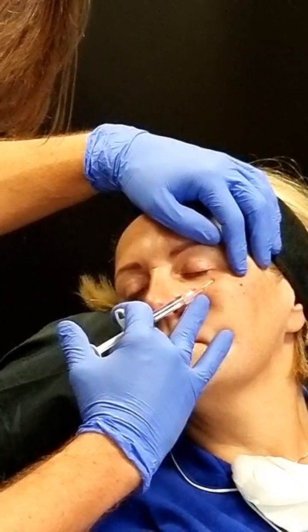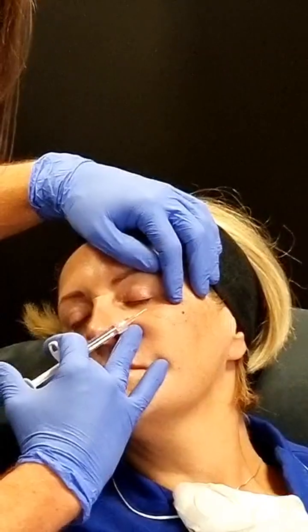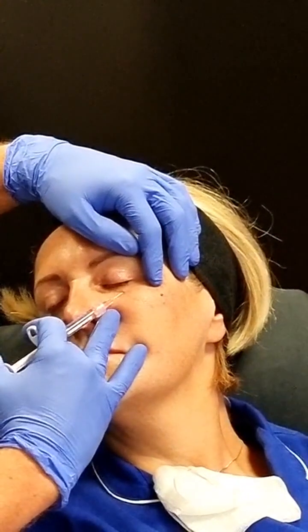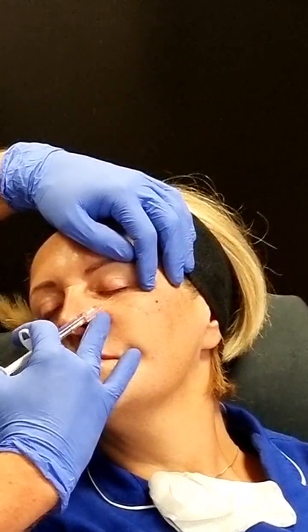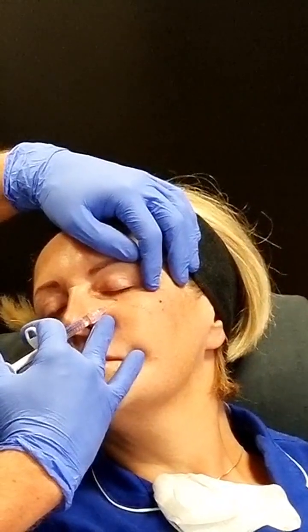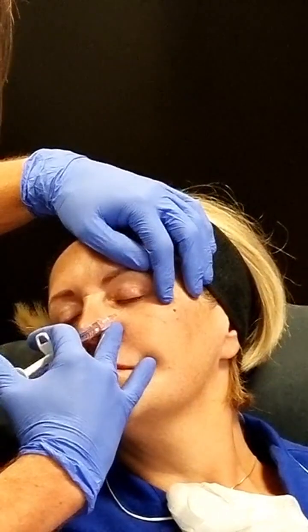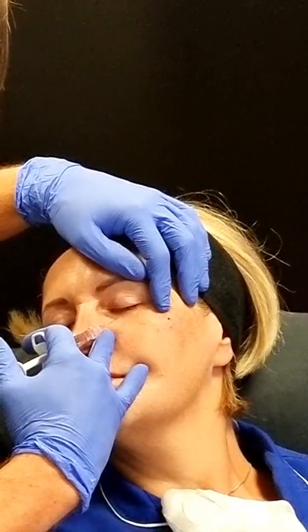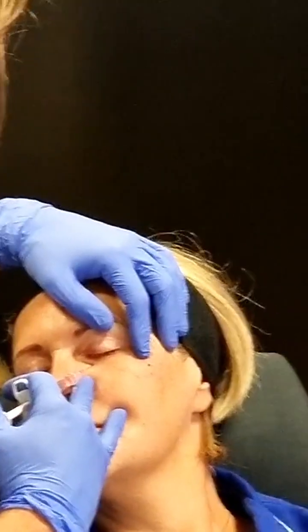And actually, looking at the very thin skin here, sometimes something might appear as being deep, but it just looks deep because the skin is so transparent, and you see the muscle underneath, which is the color of beefsteak, and you see veins and all that, giving the appearance that it's deeper than it actually is. And this dermal strengthening, you can take it all the way up.